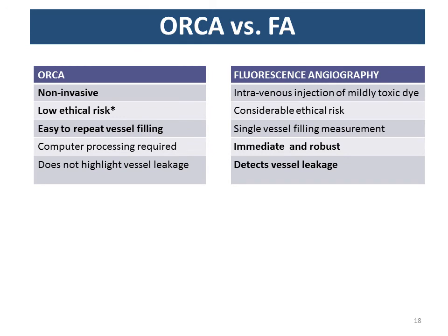So I want to compare a bit about advantages and disadvantages of ORCA and dye-free angiography versus fluorescence angiography. So ORCA, as I said, is non-invasive. We think it's pretty low ethical risk. We have ethics approval, obviously, for doing it here at Glasgow.